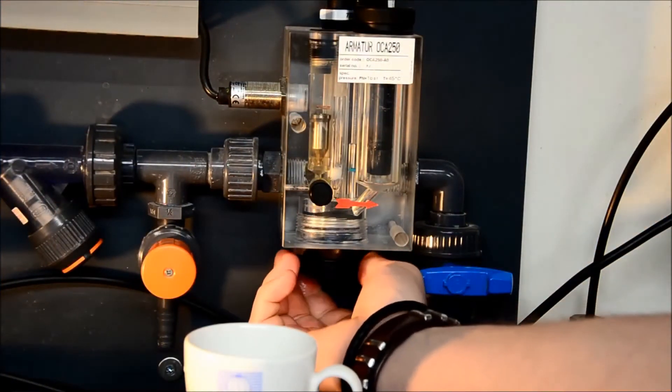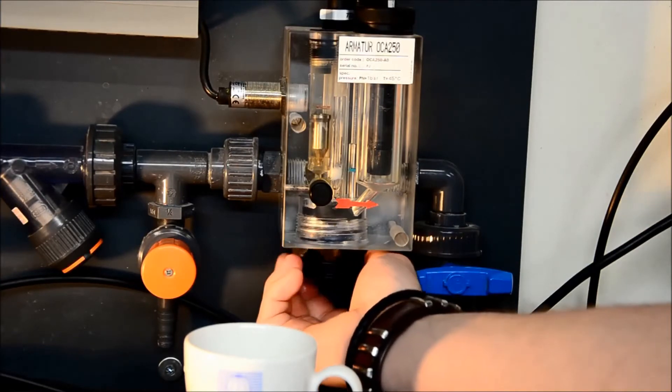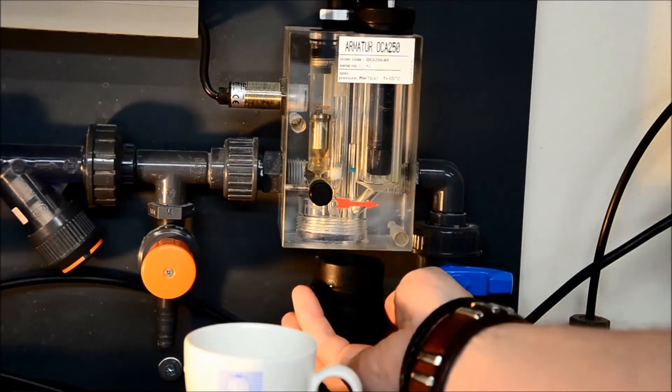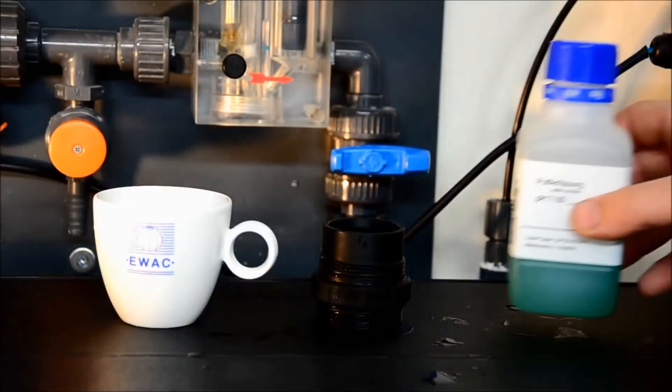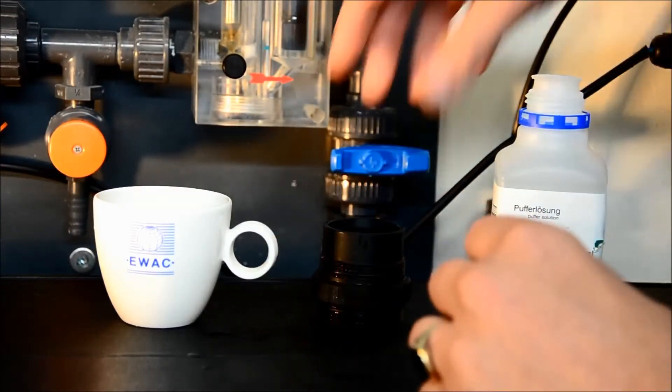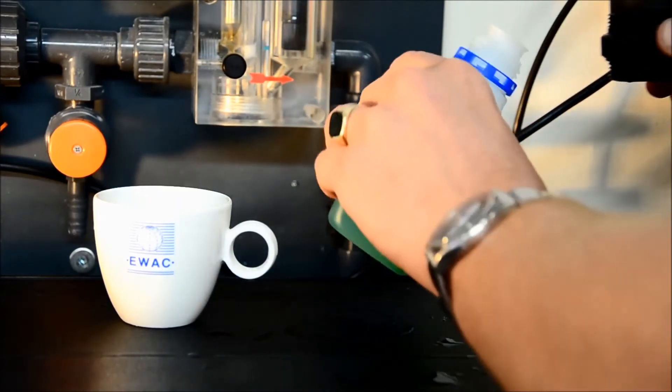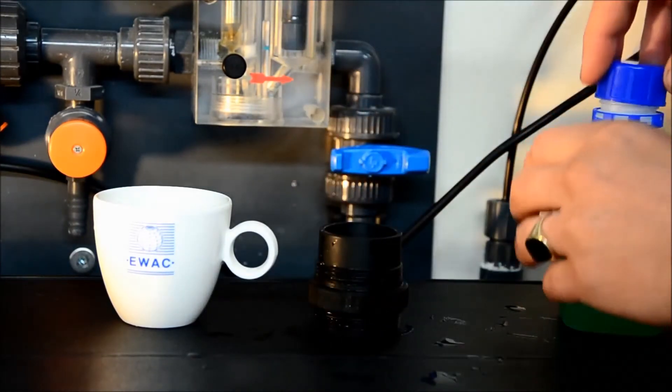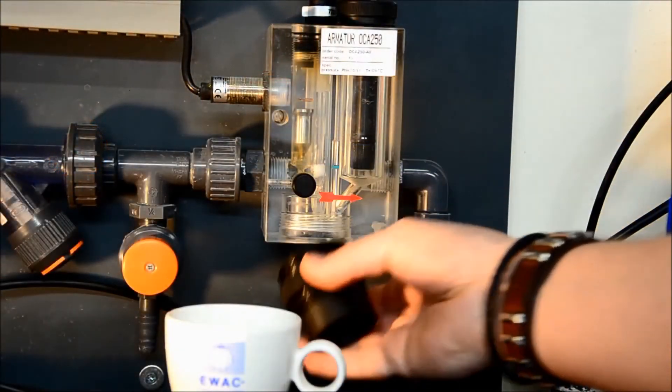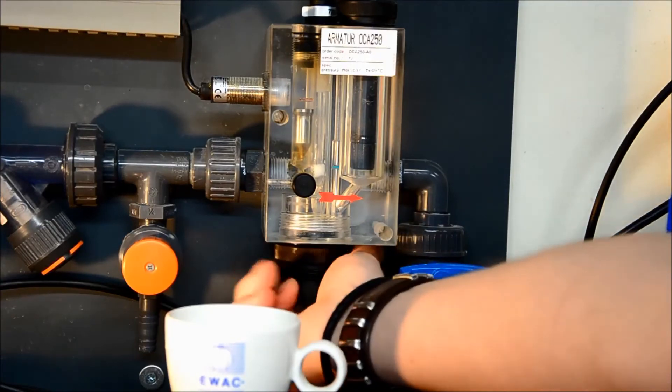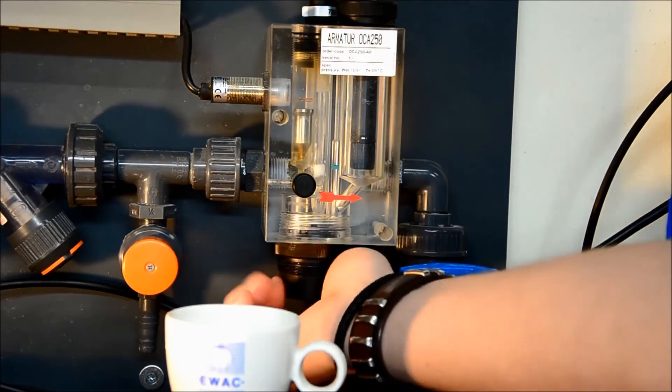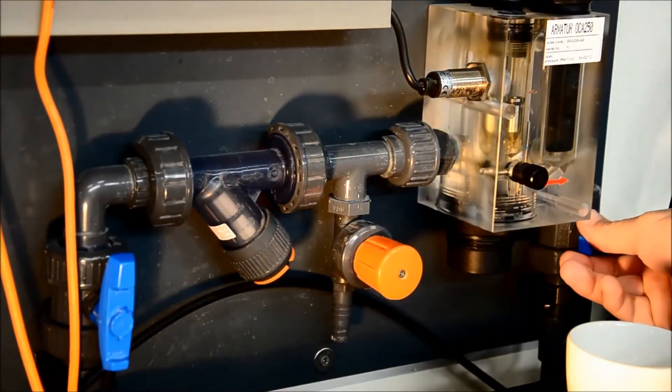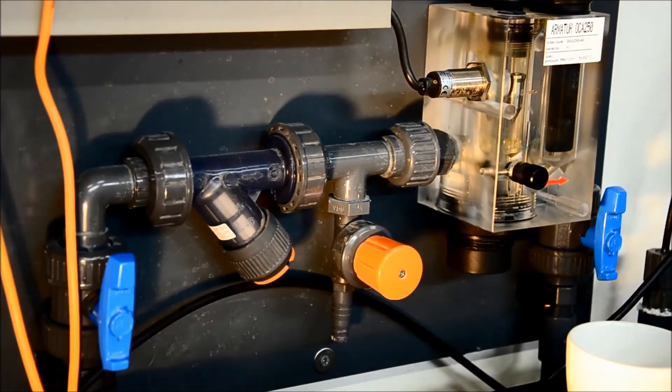Now we can remove the calibration cup from the measuring unit. The calibration fluid can be poured back into the container. After that the cap can be screwed back into the measuring unit with the shallow side up. Once the cap is tightened the isolating valves before and after the measurement unit can be opened again. This will allow water to flow through the measurement unit again.